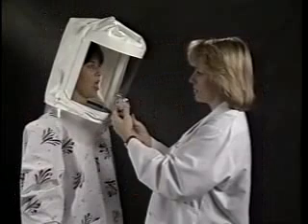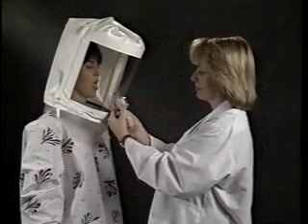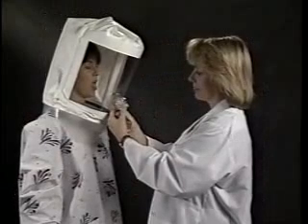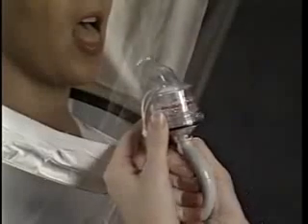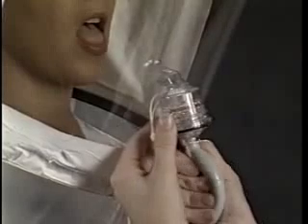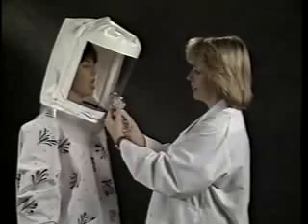Using the number 1 nebulizer, inject the aerosol into the hood through the aperture in the hood window by squeezing 10 times, always fully collapsing the nebulizer bulb on each squeeze. Allow the bulb to extend fully between squeezes. Both plugs on the nebulizer must be removed from the openings during use. The nebulizer must be held in an upright position to ensure aerosol generation.